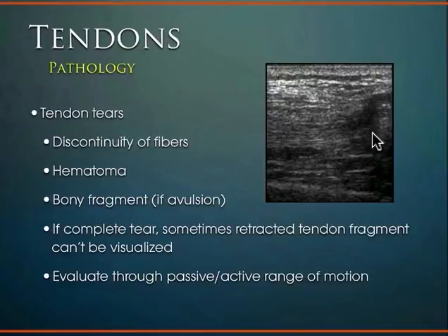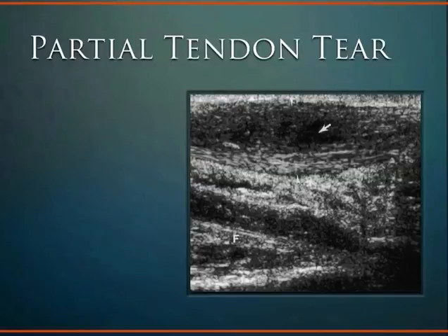with tearing in the tendon itself. And then again, it's very dynamic, and so it's pretty neat. You can then flex that tendon through its range of motion, and you actually see retraction of the tendon, instead of full nice smooth movement. So you can actually see that tear functionally, and that can be very helpful to evaluate how significant the tear is.